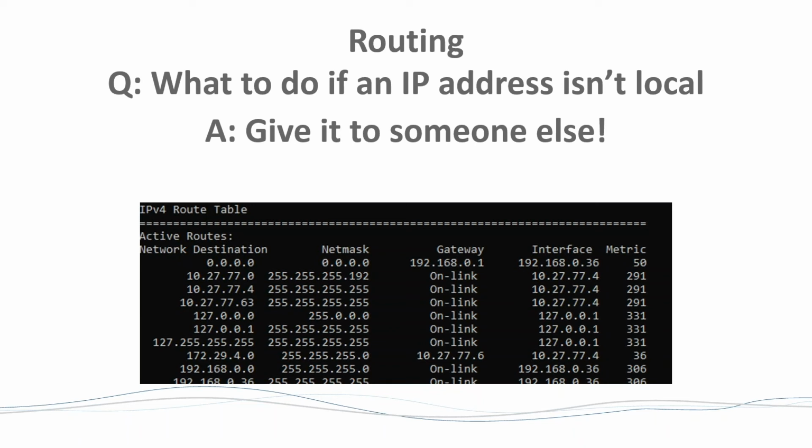So if you have a device that never needs to get outside of its network, say you have a LAN and you're going to put a monitor on it over here, and you're going to put a nurse's central station over here to monitor that remotely, and that's all they're going to do, do we need a default gateway? We don't, because they're on the same LAN, right? They can communicate at layer 2 and they'll be just fine. Don't need to put it on there. What if you have 2 interfaces on a device and you put in 2 default gateways?